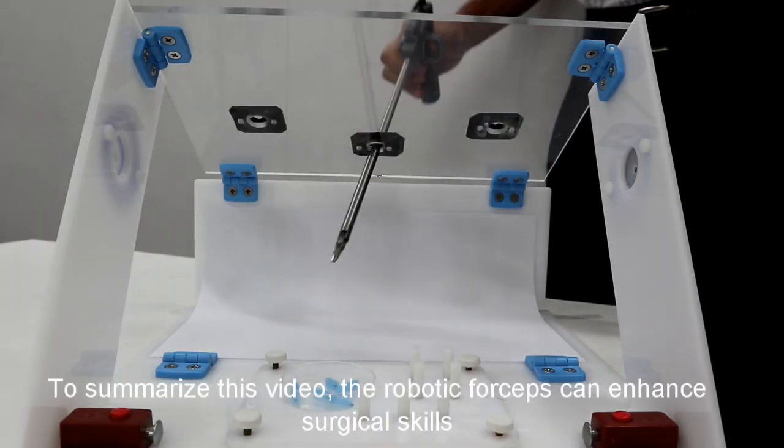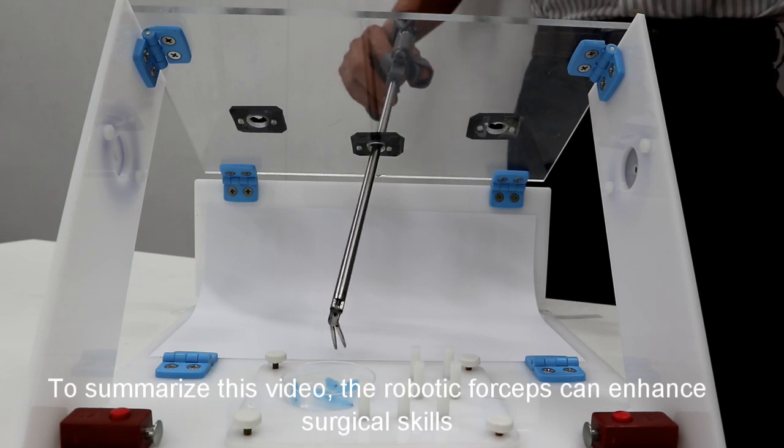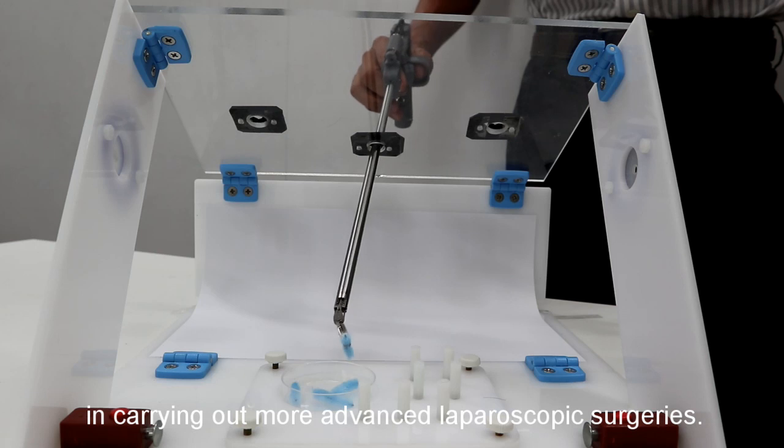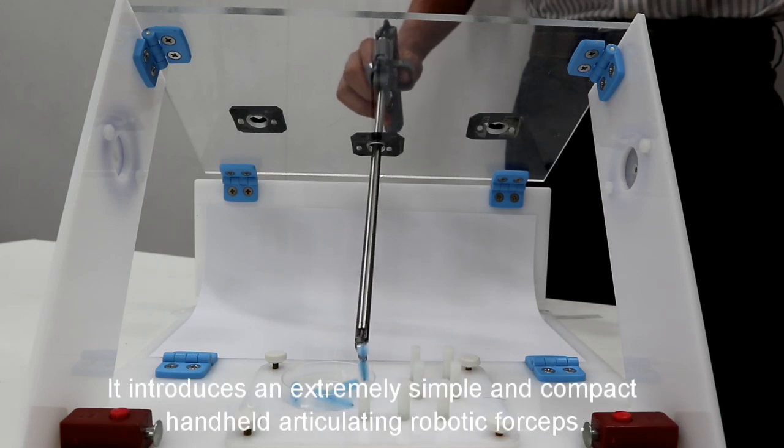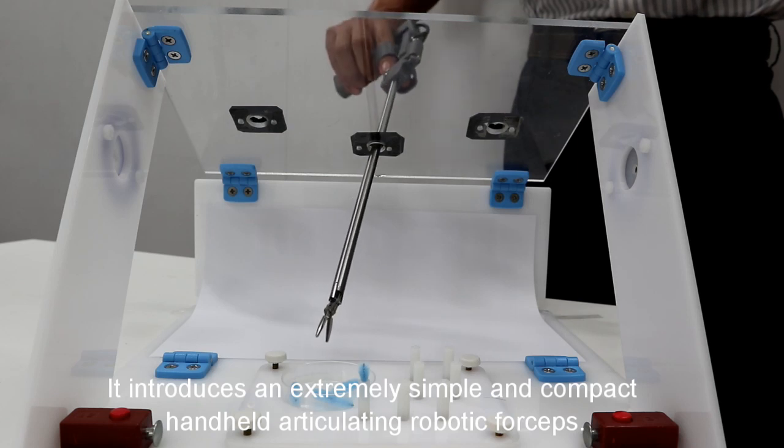To summarize this video, the robotic forceps can enhance surgical skills in carrying out more advanced laparoscopic surgeries. It introduces an extremely simple and compact handheld articulating robotic forceps.